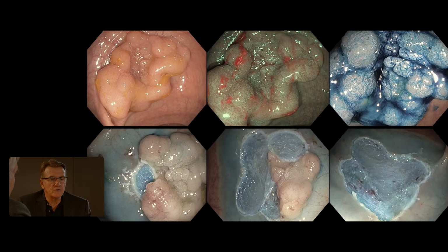Yeah, when it's got a regular discernible pit and microvascular pattern, not disrupted, then you can be relatively confident that there's no invasive disease.